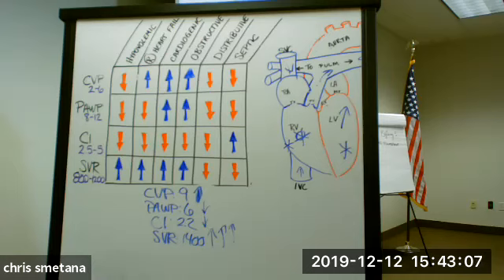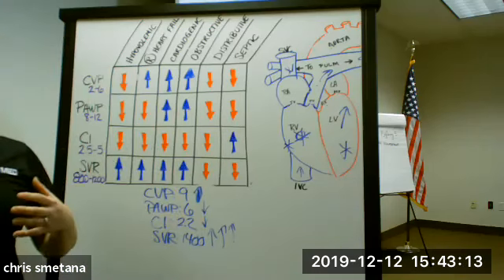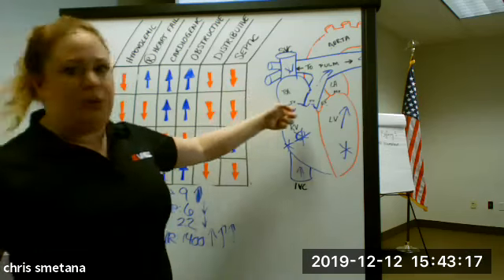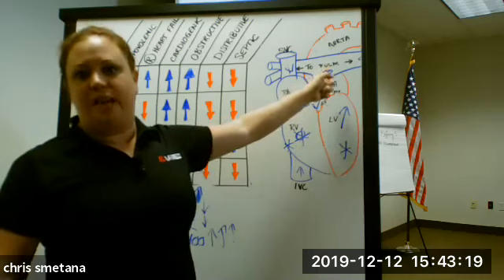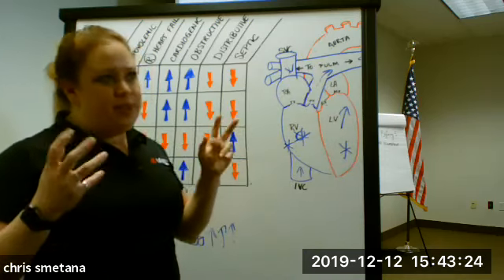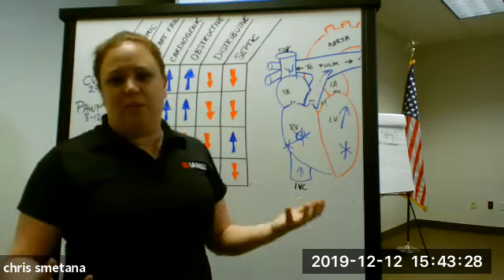Yeah, absolutely. So online we made the comment that it's a little bit easier to look at only 4 values instead of 5. And that's really the way I like to look at it. I look at 4 places. What's coming into the heart, what's leaving the right ventricle, and how is that affecting the lungs? And so while it's not necessarily appropriate to call your wedge pressure your lung pressure, it realistically is.